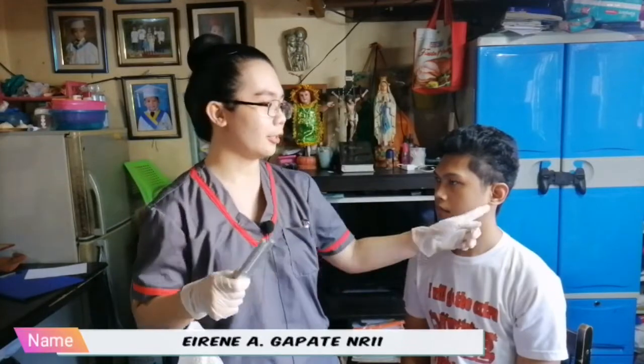Okay. So, as expected, the patient heard the tone twice as long when the tuning fork is placed in front of his ears, which corresponds to the air conduction, than the tone heard when the tuning fork is placed on his mastoid process, which corresponds to the bone conduction. Now, I will conduct a Weber's test for the last ear test.